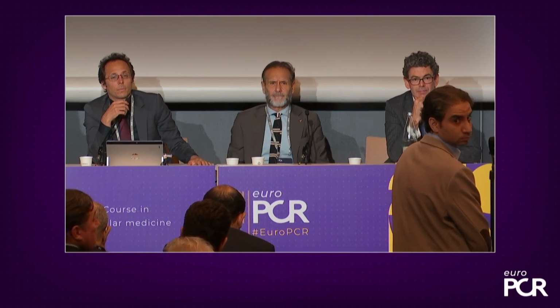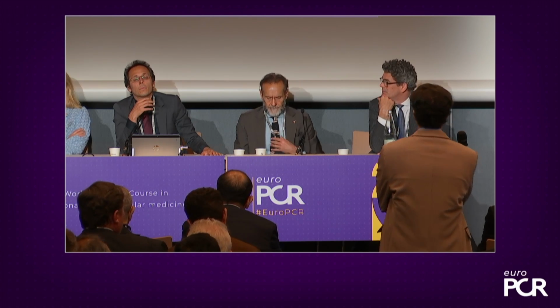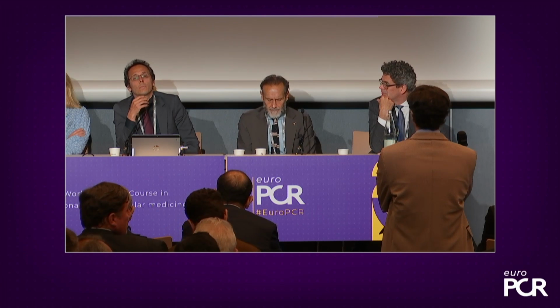Thanks. So there is a question in the back. So I would like to ask one question for Benjamin, first question, and the second for Jonathan. So Benjamin, could you please tell us what about putting the stent from the left main to the LAD and then just check the physiology, IFR, because angiographically it was not significant in the middle part of the LAD. Even in OCT you can see the tight lesion.